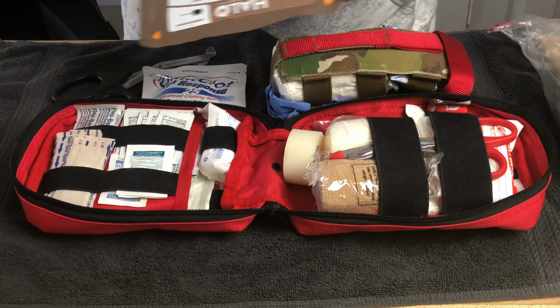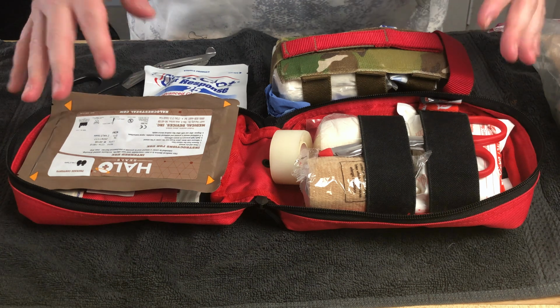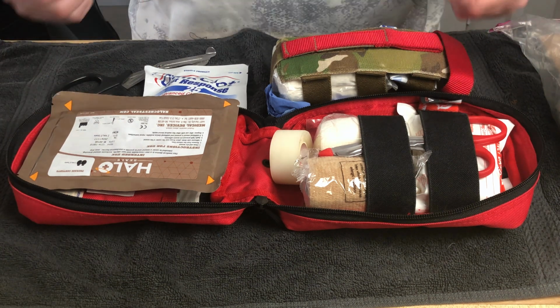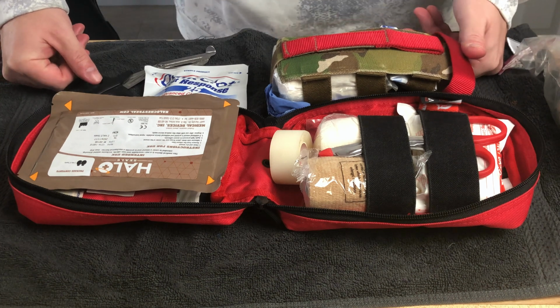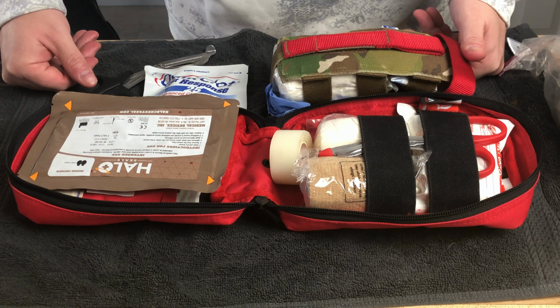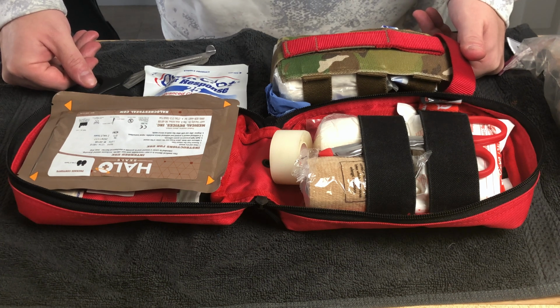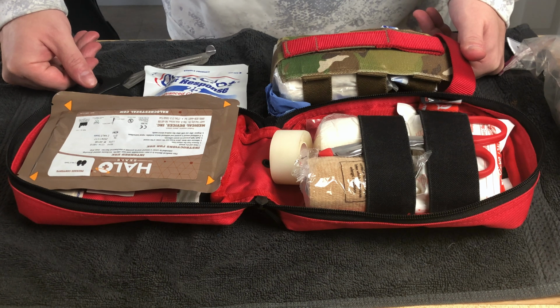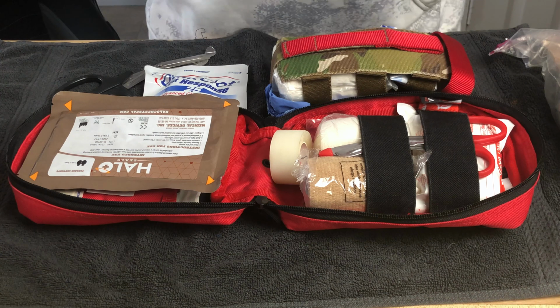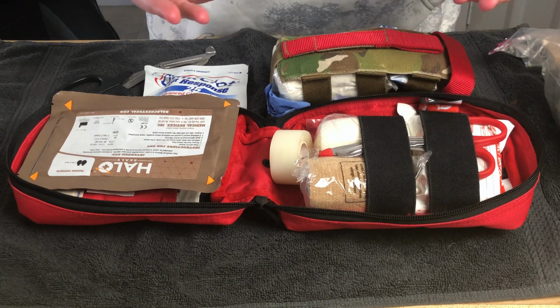It's under the halo. Like hand wipes in here. Honestly, 99% of the time, that's what gets used, is the little stuff. And the reason for that is obvious. Day to day, you don't get gunshots. You don't have major knife wounds. You don't have car accident injuries, unless you are an EMT or a paramedic or a fireman or policeman responding to a major event. So I've got the stuff, but honestly, it's the bare basics.